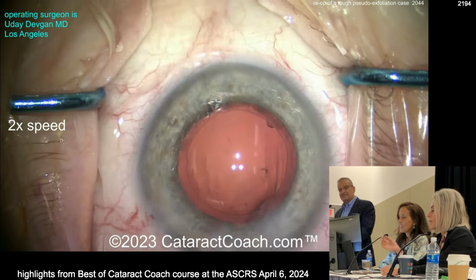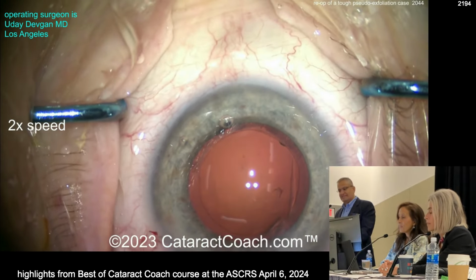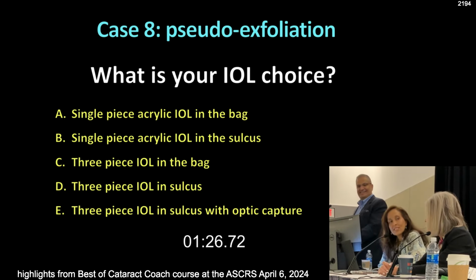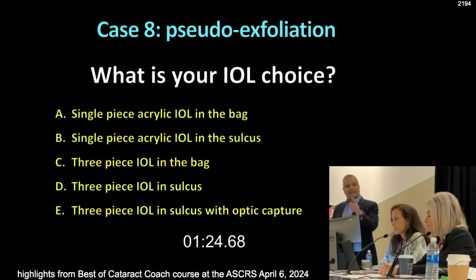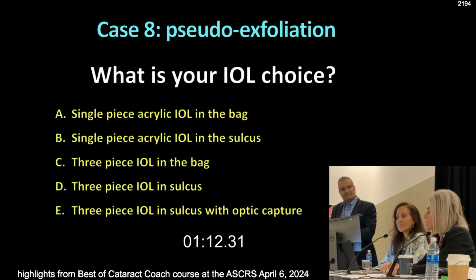Oh, very good. To make sure you're not surprised the next day. Absolutely. And that goes for floppy irises as well. And don't ask me how I know. So do you lift the iris? I do. Yeah. So at the end of the case, use like the chopper, lift the iris. I kind of sweep tangentially with the IA to make sure, do a little wiggle in the middle to try to get the forces to bring anything to me. Otherwise, you can lose a piece under the iris, especially these honey-colored irises, the blue-orangey irises, and you're going to have to go back in and take it out.